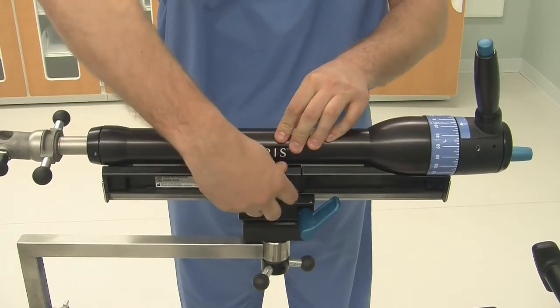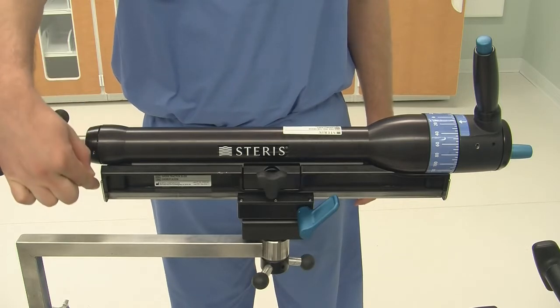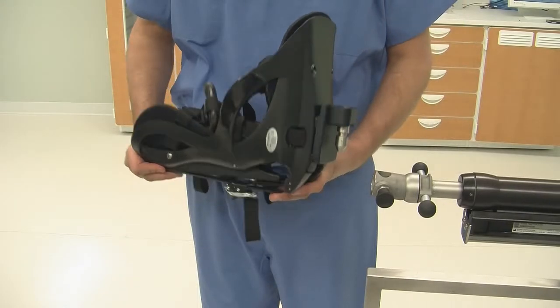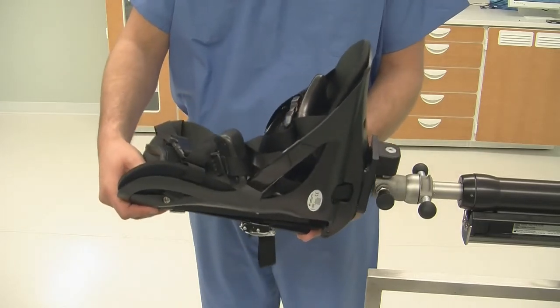Verify the fine traction and gross traction is aligned as pointed out here. Attach the boot assembly to the fine traction assembly by placing the boot prong into the hole on the fine traction assembly. The pin will drop in and click into place.